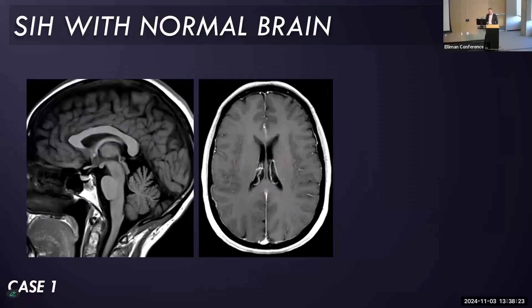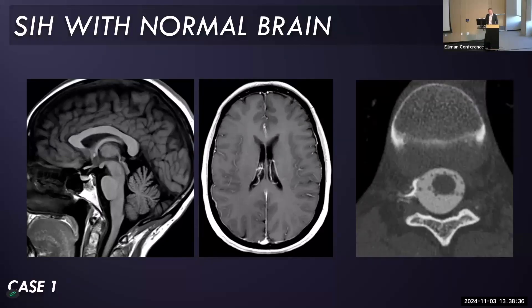This is another patient — no transverse sinus abnormality, no brain sagging, no dural enhancement. I think this really was normal brain imaging, but this patient also had a CSF leak. On the myelogram you can see a small dural tear laterally in the mid-thoracic spine.